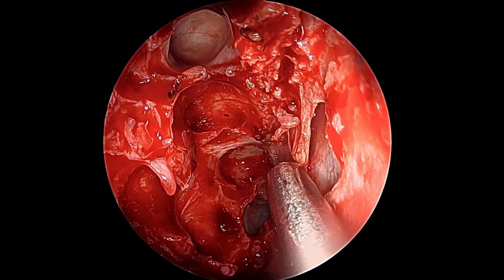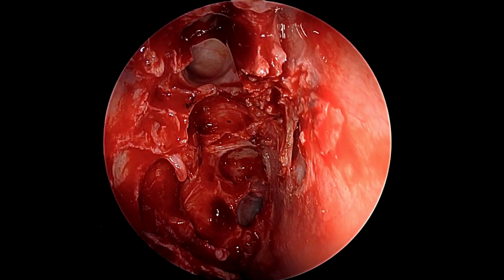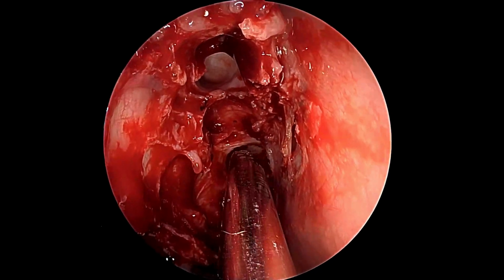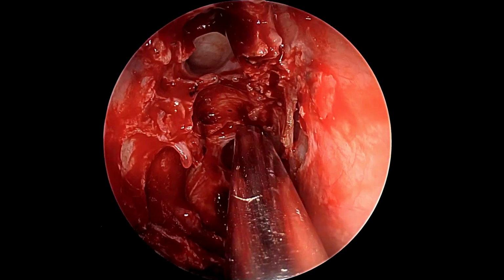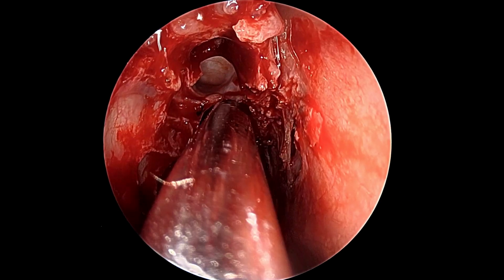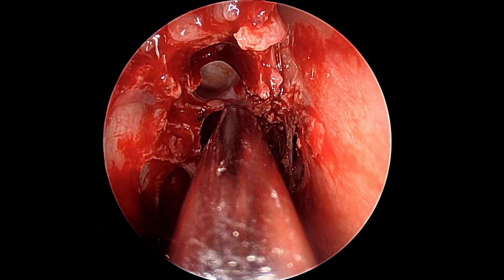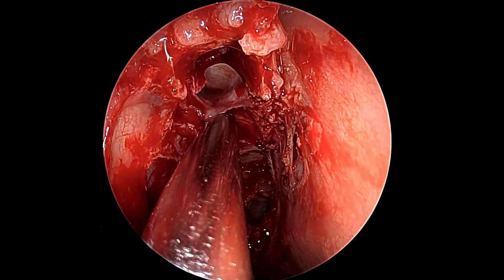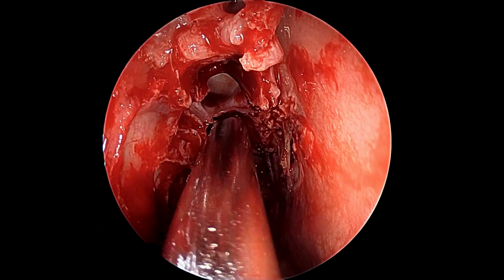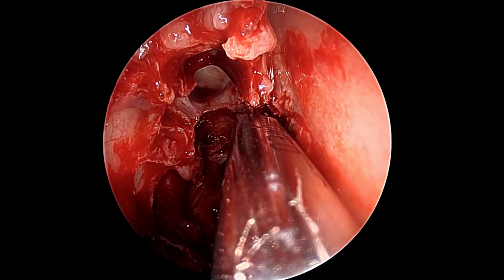So the entire skull base, right from the frontal recess to the sphenoid sinus, can be seen here in one go, from anterior to posterior, along the septum, which is medially, and one can see how even now some bit of flattening has to be done to make our defect amenable for successful reconstruction. Any half-hearted plugging of defect simply without doing all these steps, without creating enough bare bone, without removing enough mucosa, is bound to fail eventually, as the graft does not get a right surface to stick on and achieve vascularity.